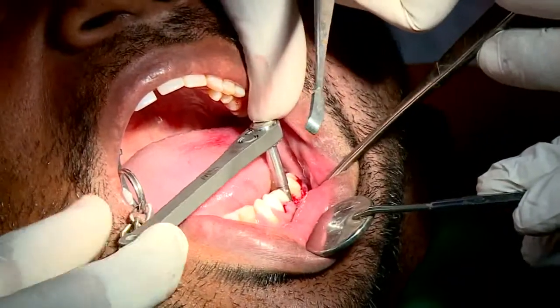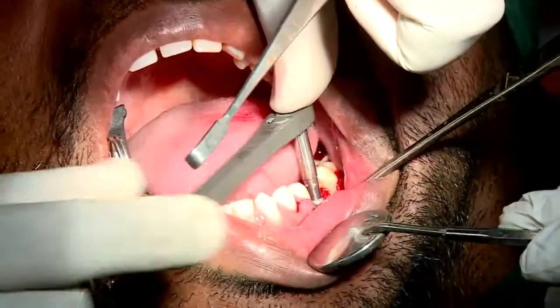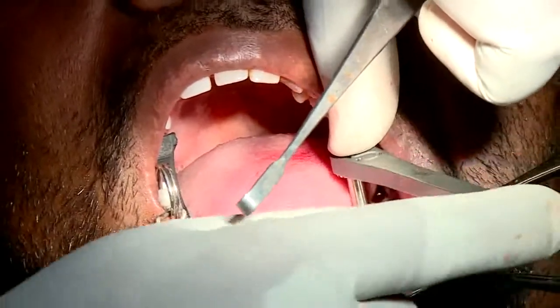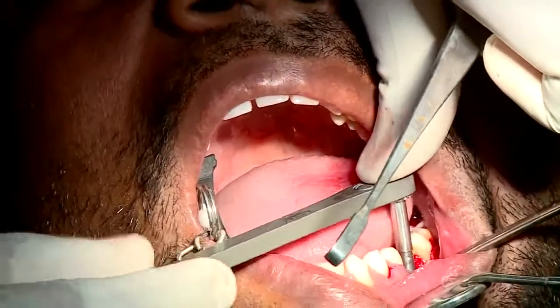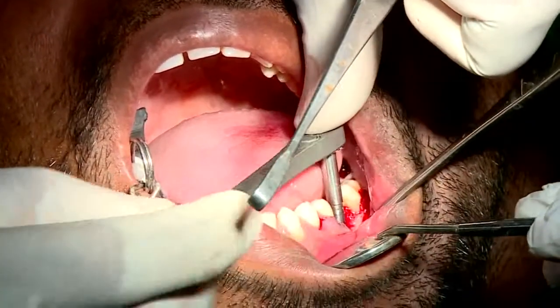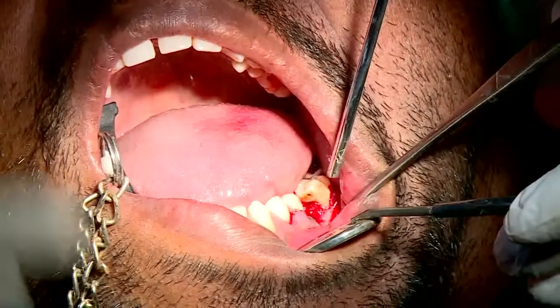Loosening, tightening, tightening, tightening. Can we see the implant at all, where it is going? Yes. And I am actually using very little torque. So in fact, my decision of keeping it one step down, I think at this stage is better. If I had gone for the next drill, my implant may not have the type of stability which I would really like. I don't think I have fully driven it in, but I would like to show where we are. I think we are almost there.